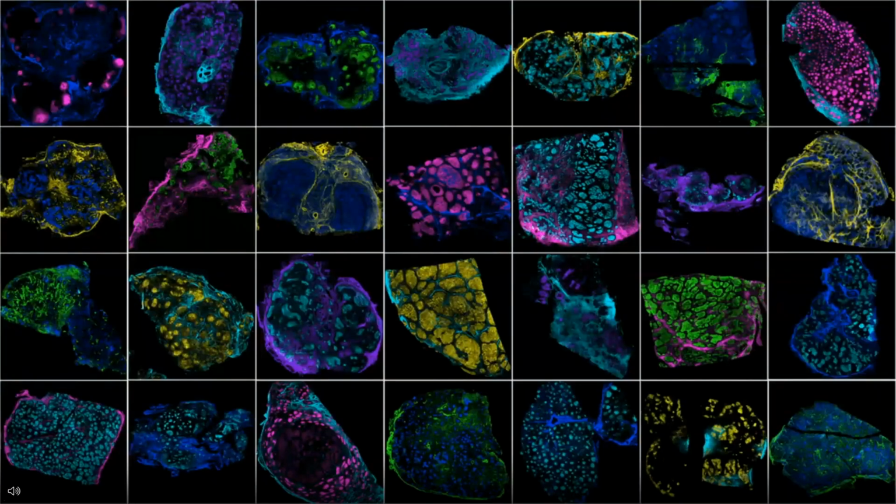And so then finally, there's not only incredible heterogeneity within the tumor, there's even more heterogeneity across samples. And that's what we're working on with our validation cohort. I visually display to you, pseudocolored in wild colors, all the different samples arrayed here. You'll immediately appreciate differences in the size of the follicles, the shape of the follicles, the amount of extracellular matrix; these samples are very, very different. And we want to capture that difference and understand why it's different.